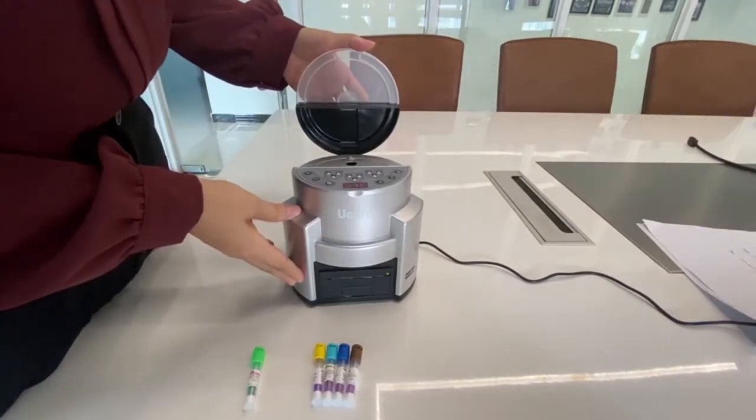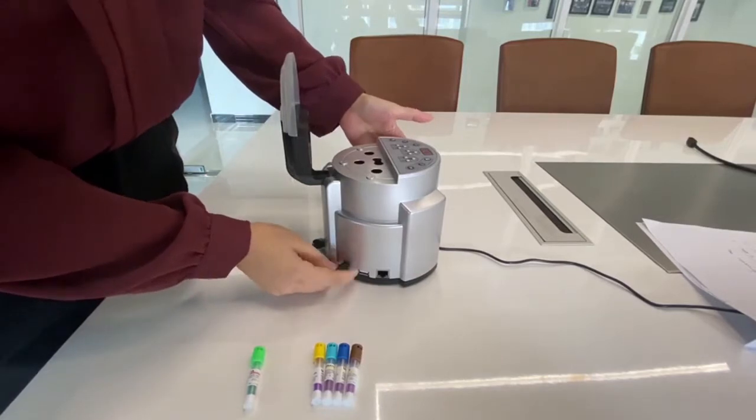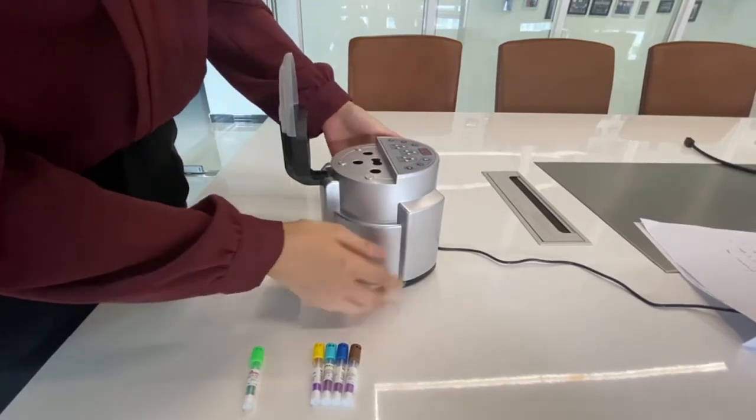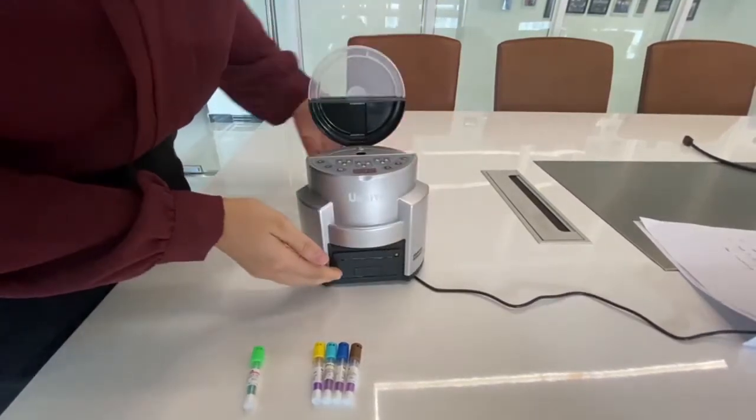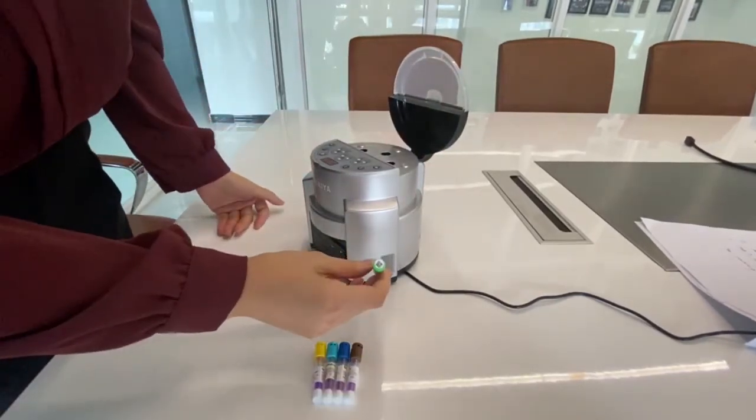This is the UGAIA mini reader. Here is the power cable, USB, LAN, and this is the printer. Here we have a scanner for scanning the barcode of BI.